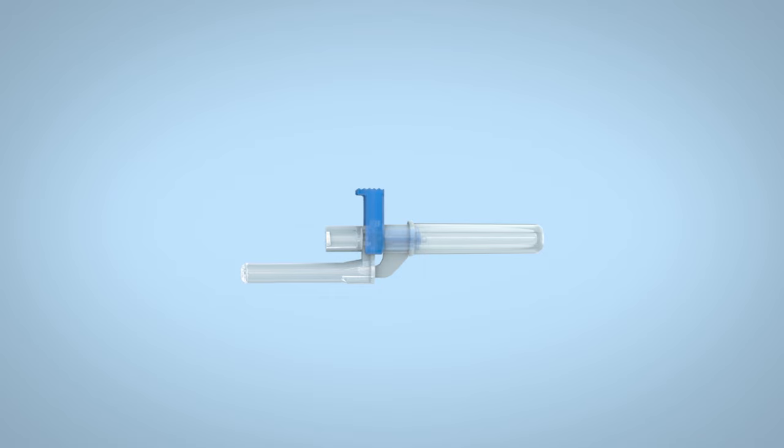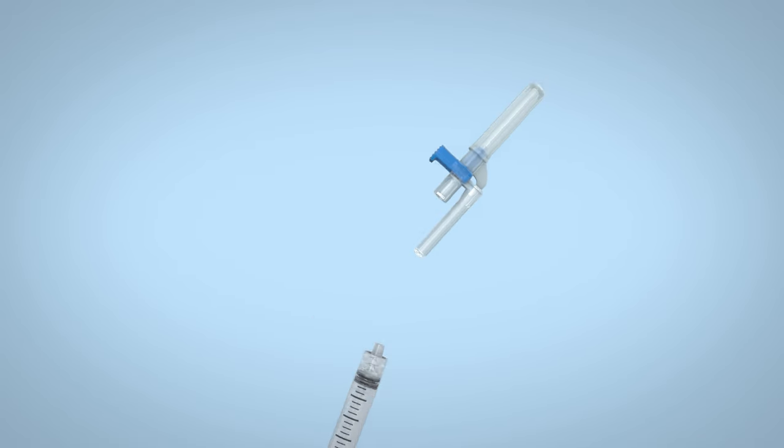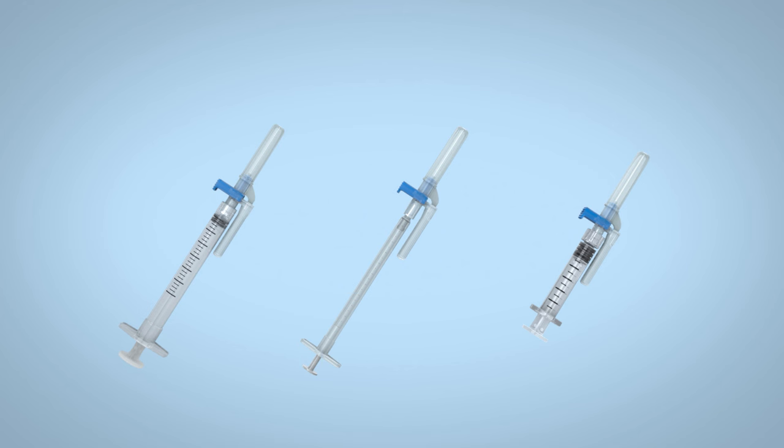EasyPoint needles have a standard lure hub that is compatible with lure lock and lure slip syringes, including pre-filled syringes. EasyPoint needles can be used for either injection or aspiration purposes.